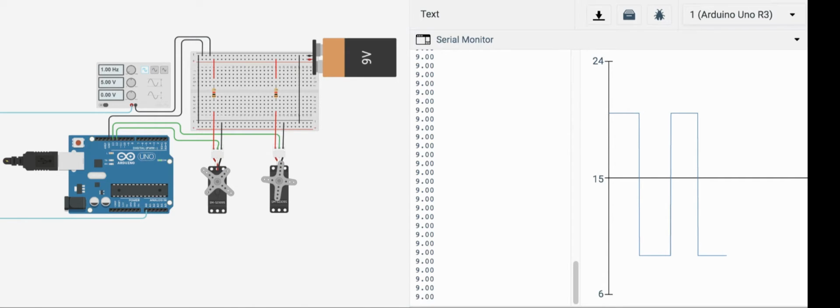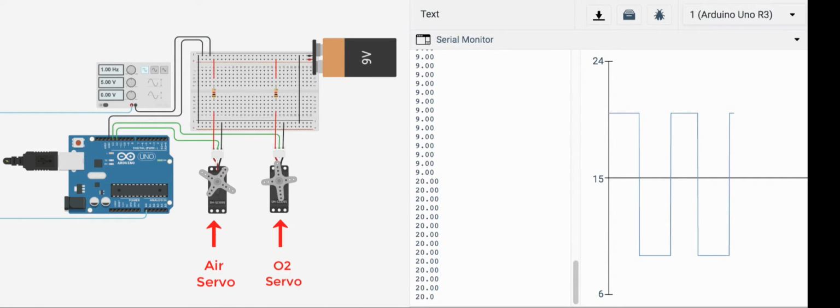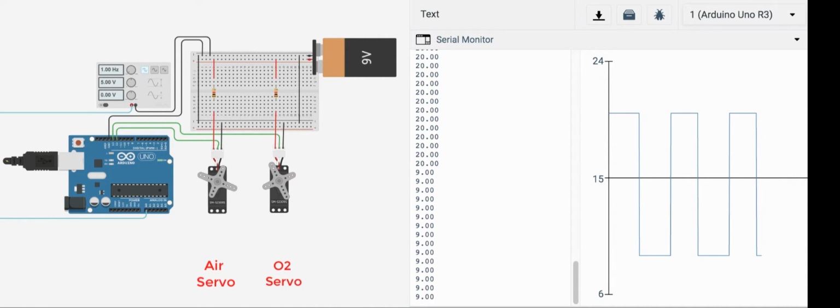We then deliver flow by actuating our scuba regulators, such that the total pressure experienced by the lungs is a combination of their negative pressure and our positive pressure in order to create the desired peak inspiratory pressure.